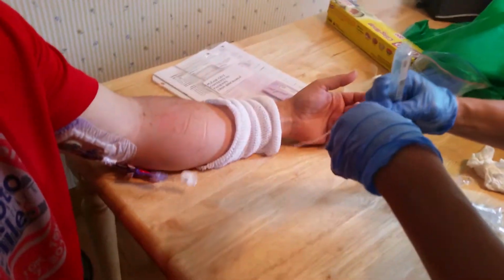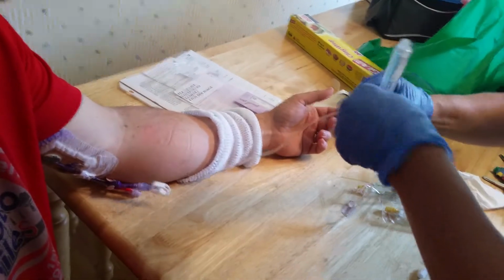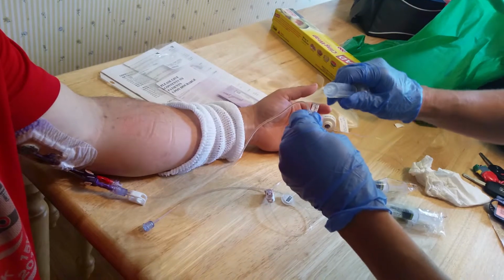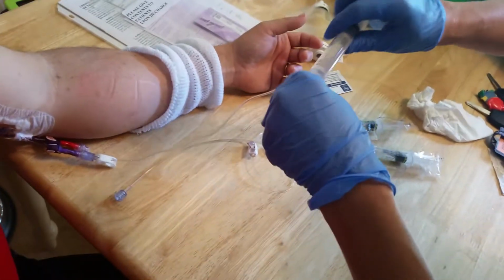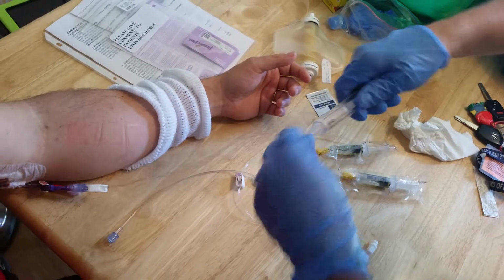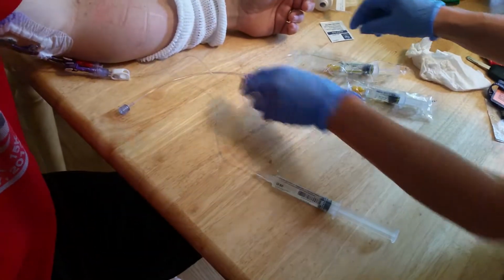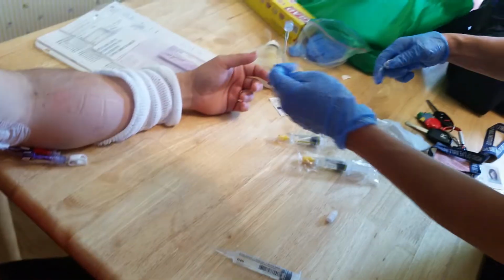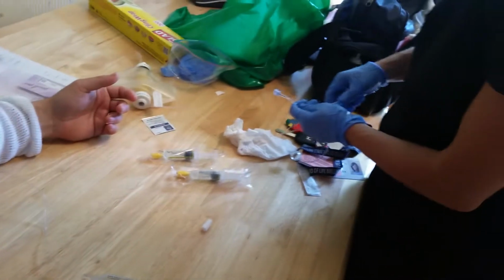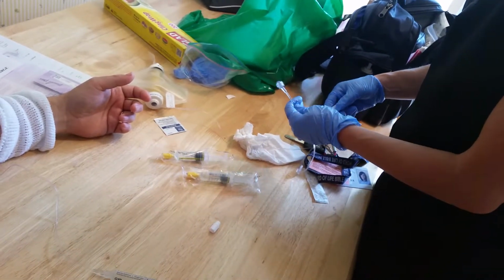I'll see when you disconnect it, there's naturally a little bit of a bubble there. There's really not a whole lot you can do about that. Can you draw it back a bit to see if there's anything or no? I'm going to unclamp this and just see if there's anything still dripping from it. Nope, there's nothing dripping out of it anymore, so that means it's gone. Okay. It's good.